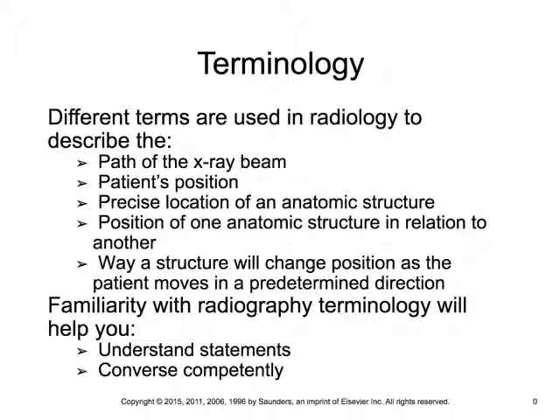And then we need to be able to start to mentally rotate this stuff in our mind as we're looking at these pictures to think, okay, is the person rotated too much to the right or to the left, right? That's because it's going to look a little bit different on the pictures. So familiarity with these radiological terms is going to allow us to be more conversant about this stuff, and it will help you understand statements that we're making in class, right? I will probably try to encourage and correct you when you're not using radiologic terminology from this point on. Do the same to me, right? Because it's easy to lapse in and out.